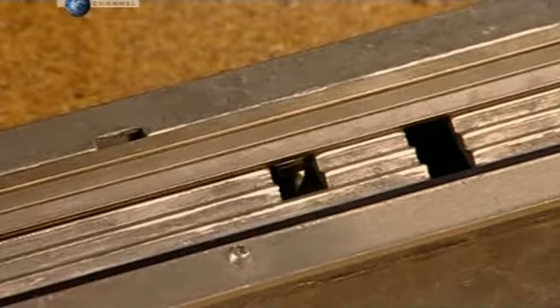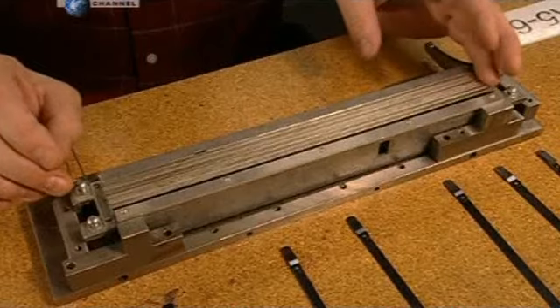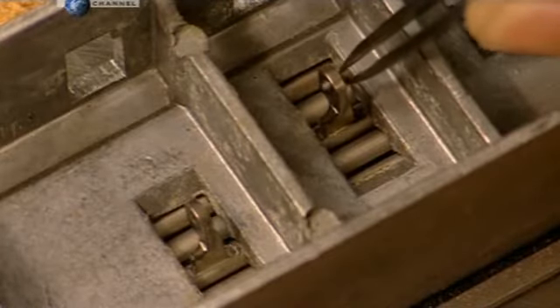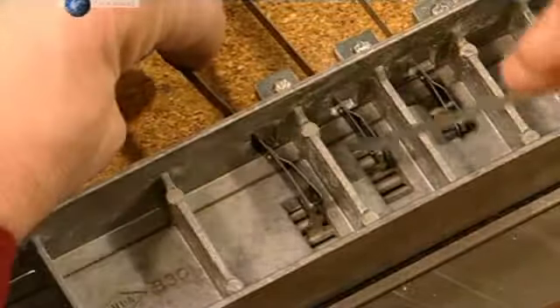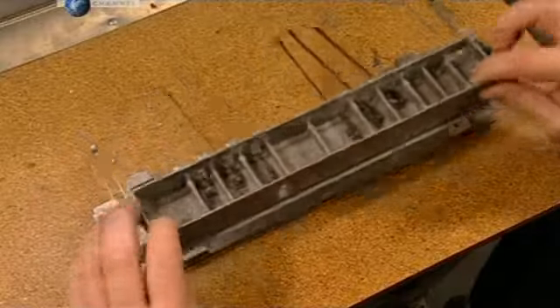The first part is a steel cam rod. One end of it has a small eyelet called a lug. A pin is put into it. Then it's slipped through holes in the prongs of a metal strip called a link. Later, the other end of the link will be connected to a lever attached to a key.